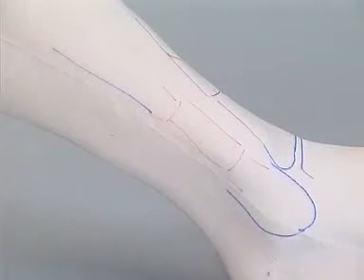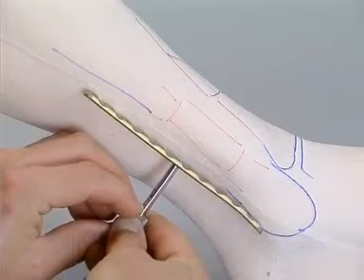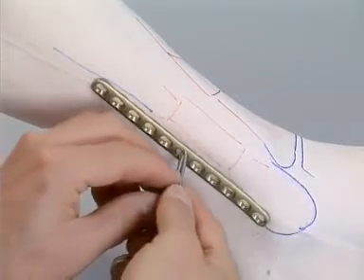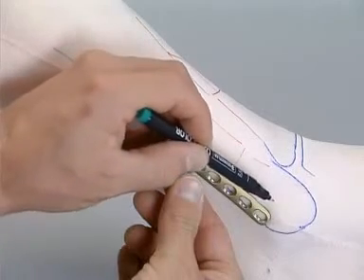Here, too, the corresponding landmarks were drawn in with the approximate location of the fracture. The 11-hole 3.5 LCP with the distal end bent slightly outwards serves as reference for the planned incisions, which are first marked in.